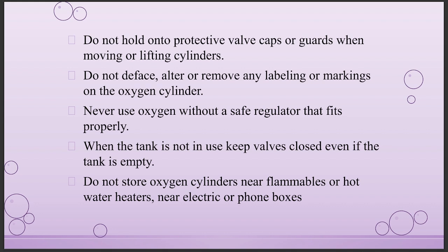Do not hold on to protective valve caps or guards when moving or lifting cylinders. Do not deface or remove any labeling or markings on the oxygen cylinder. Never use oxygen without a safe regulator that fits properly. When the tank is not in use, keep valves closed even if the tank is empty. Do not store oxygen cylinders near flammables or hot water heaters, or near electric or phone boxes.